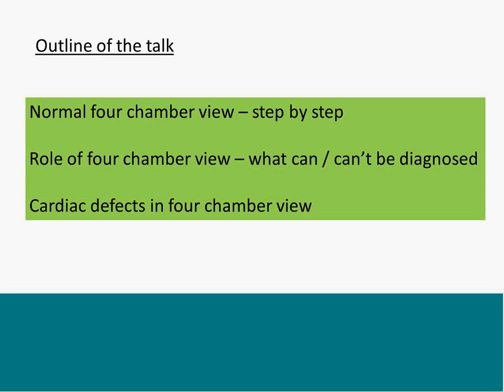This is important because initially the concept of fetal echo started with an understanding of doing a basic scan, which included only a four-chamber view. And it is an important step to be followed by all radiologists. However, over time, it was realized that it can pick up only 50-60% of the cardiac defects, and hence the outflow tracts were included over time, which then can pick up to 80-90% of the cardiac defects.